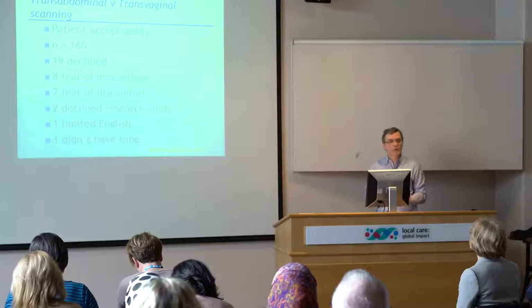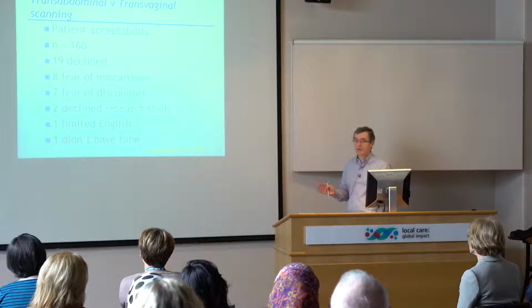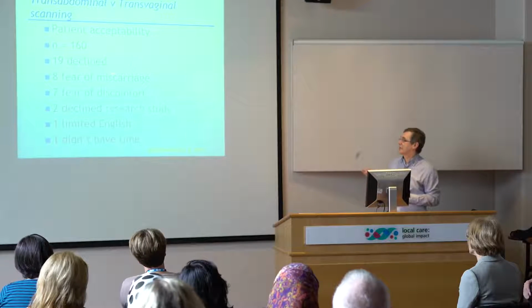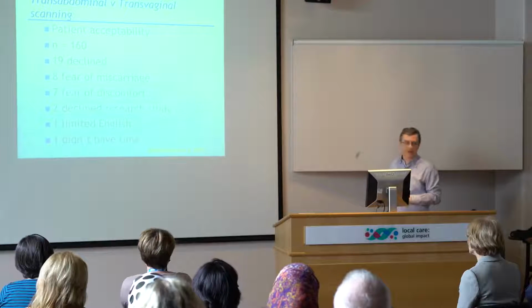So there's very little work about patient acceptability in the UK in the first trimester of pregnancy. And I think this is the biggest paper looking at that. They looked at 160 women who were pregnant. They weren't necessarily multiple pregnancies, they were just people who had turned up for their first scan, no specific risk factors, and they were asked if they would undergo transvaginal scanning as well as transabdominal. Well, 19 women declined, 8 because of a fear of miscarriage, 7 a fear of discomfort, and 2 just said that they didn't want to do any research studies. 1 person didn't speak English, and 1 person said they didn't have time to have both.